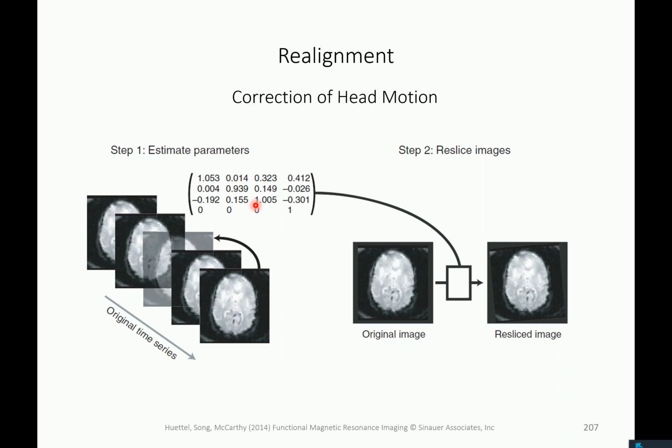So let's say this is the original image, and then your next image is that. What the algorithm tries to do is use rotation and translation. So let's say it's like this. It tries to do a translation and a rotation so that they are aligned. This is of course a technical algorithm, so you need some kind of loss function, and you try to get to the point where you have minimal loss. And then you can try different translations and rotations to achieve that. Once you have achieved that, you of course know for the second one how you got there, and these are then the parameters.